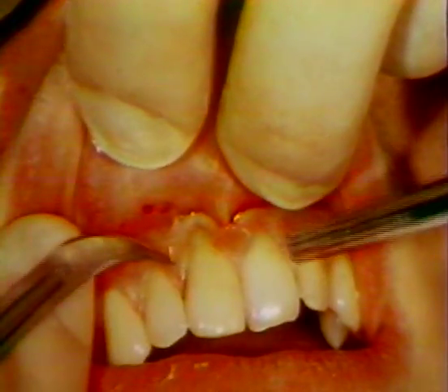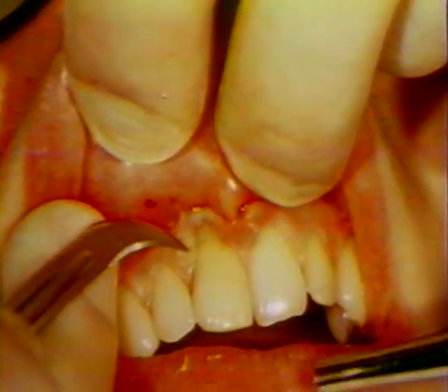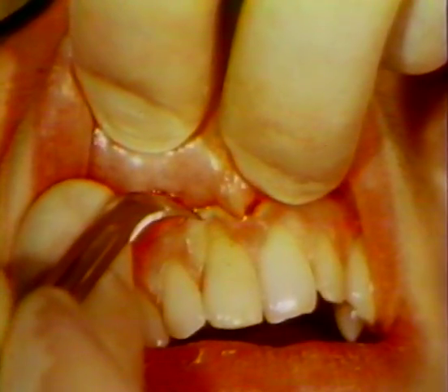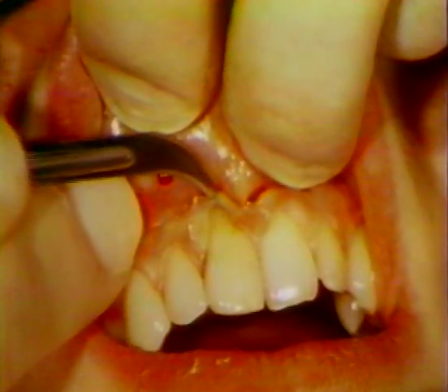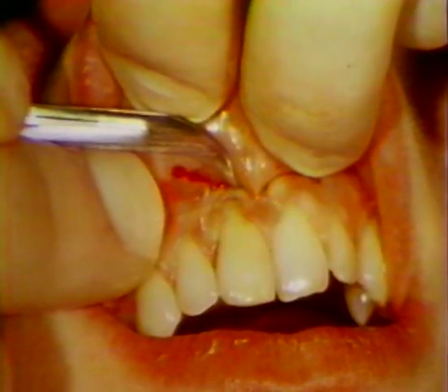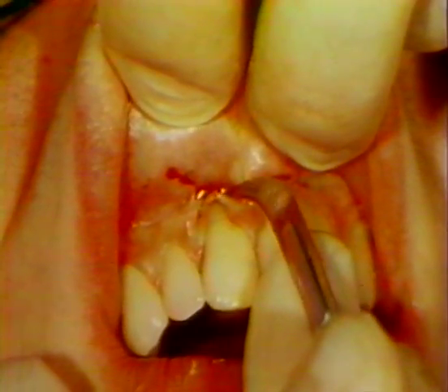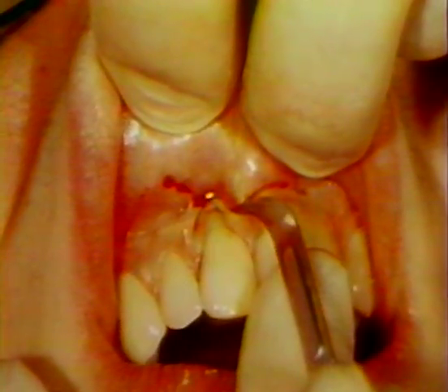After the area has been anesthetized, in preparation for a lateral sliding flap, the initial incision is made with a Bard Parker number 12B blade. The purpose of this incision is to excise the crevicular side of the free gingiva on the labial aspect of the tooth. The scalpel is directed toward the bottom of the gingival crevice.